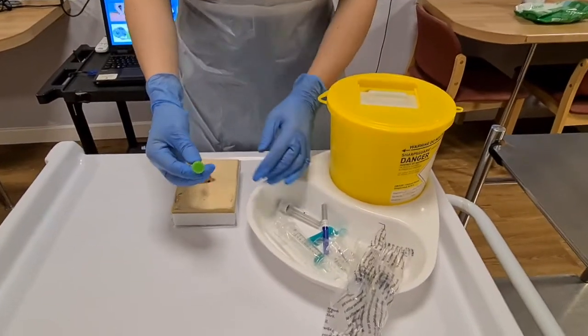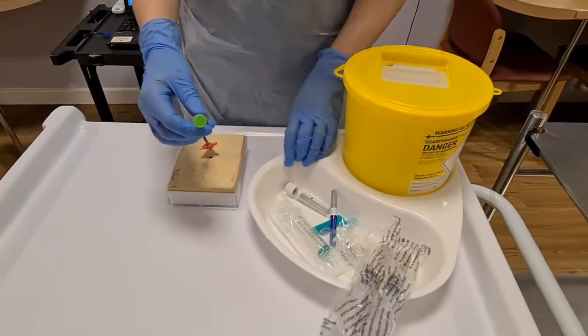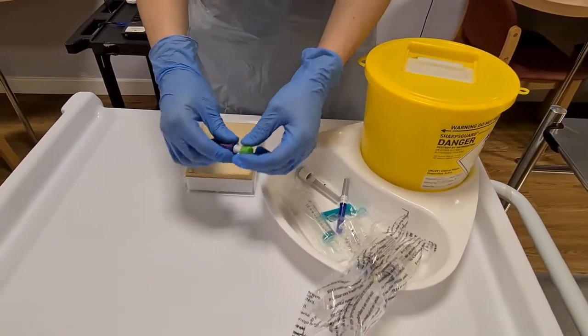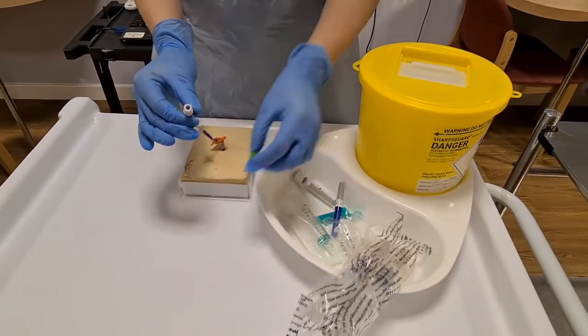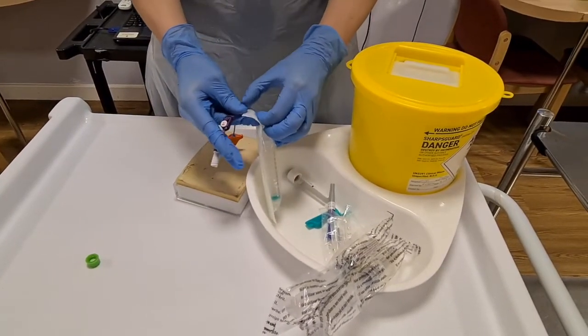So to take blood from a PICC line, if you want to just do normal bloods, what you do is you take off your Curos bung. You open a syringe, a 10ml syringe.